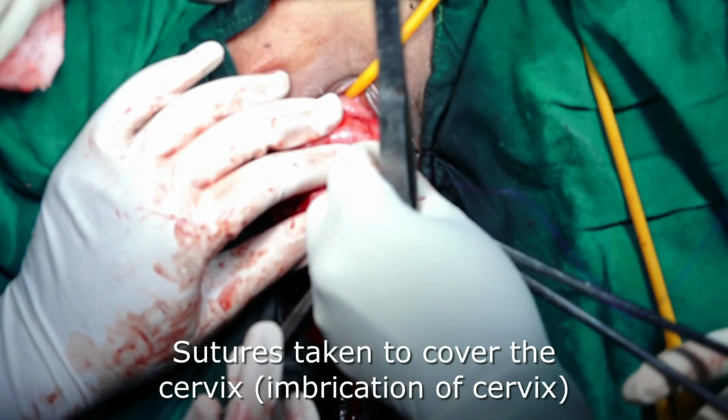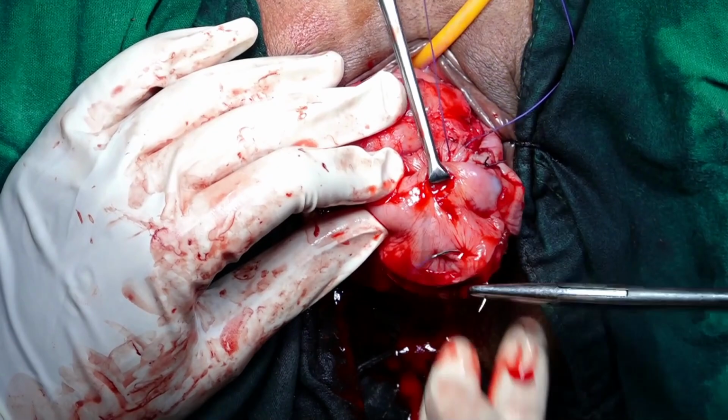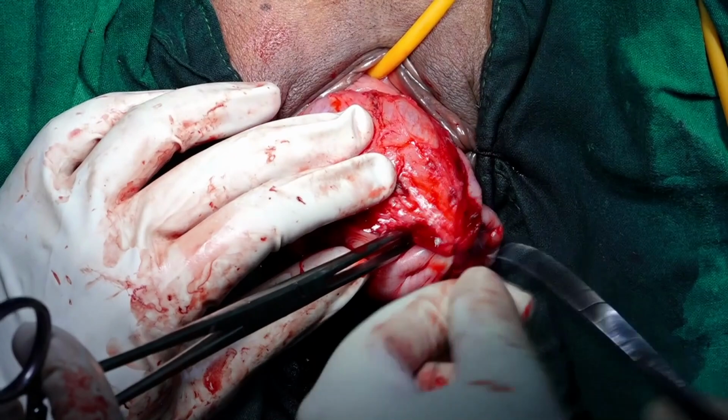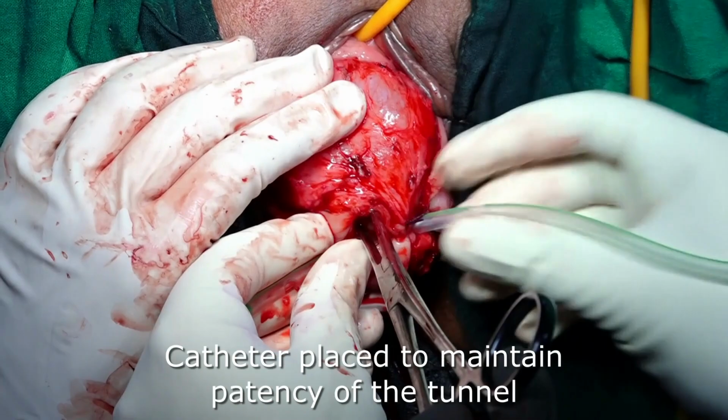Note, the bite is first taken through the fascia, then through the vaginal mucosa anteriorly, and then posteriorly through the vaginal mucosa and back again through the fascia. The suture is then tied. Here we are using Vicryl 2-0. A catheter, in our case a Ryle's tube, is then placed in front of the cervix to create the tunnel.